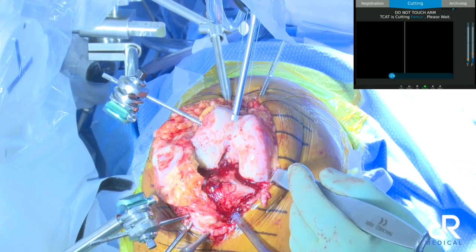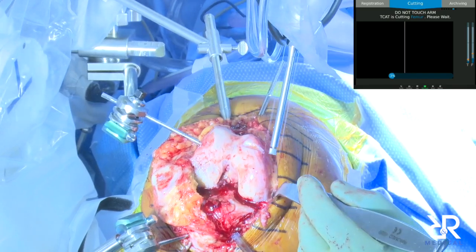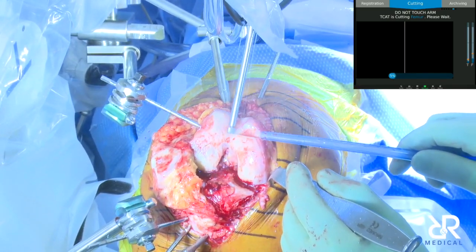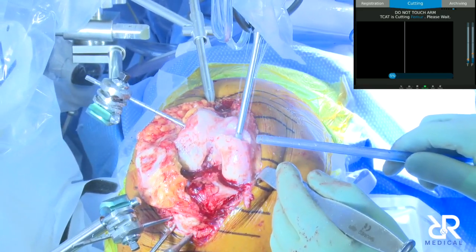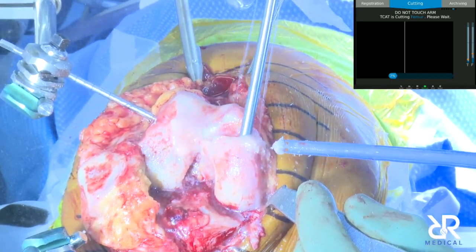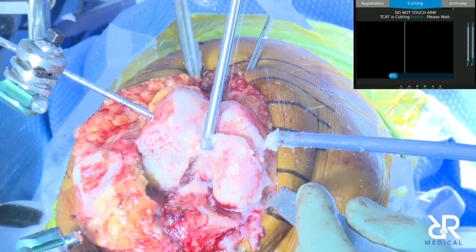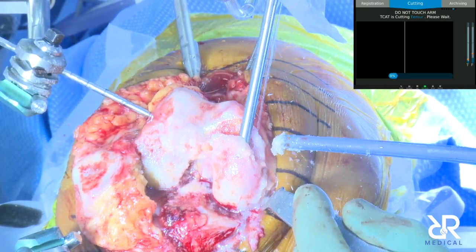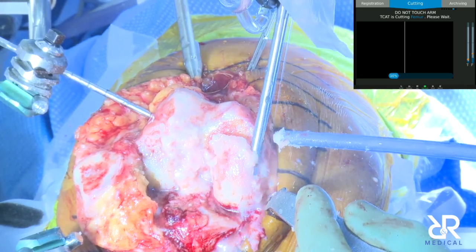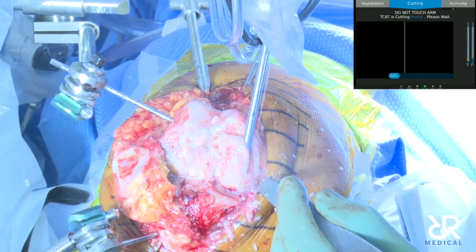I try not to use Stryker for anything, not even my suction tubing. I use Corin, which is a UK company that I helped develop their knee. And then on this particular case, we're doing United Orthopedic Group. And so those are the two that I've used with the Think Surgical robot.